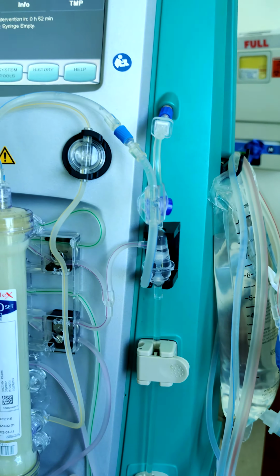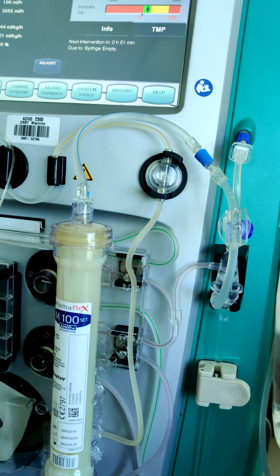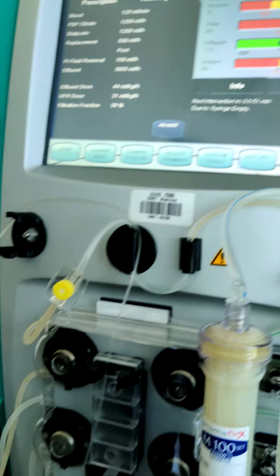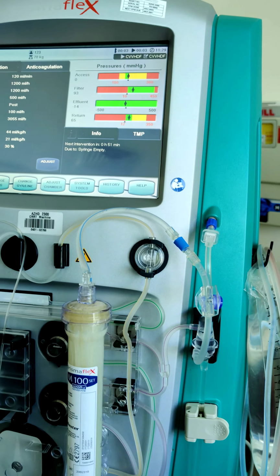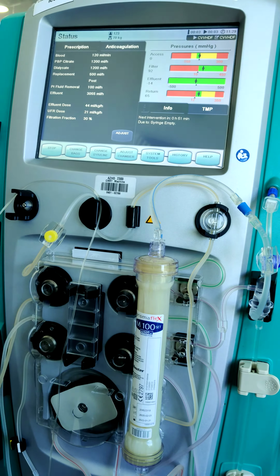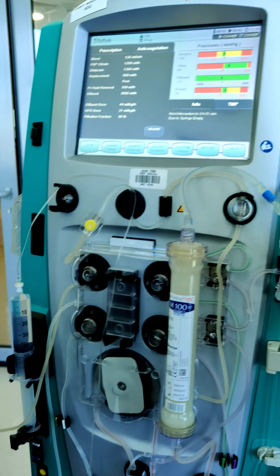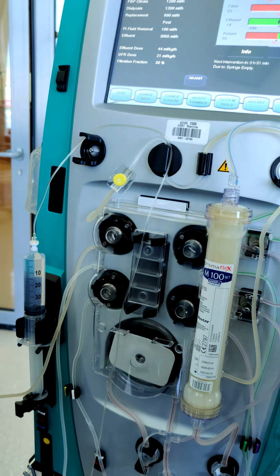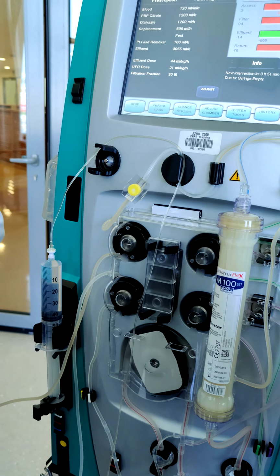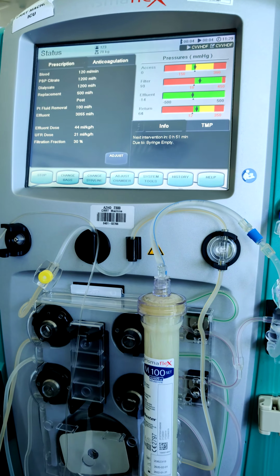Let's assume that we find the patient 1.4 and the circuit is... let us check the table, just to see an example. Ionized calcium. What's the result? We find the patient 1.5 and the filter 0.1. Okay. Let us take this report.